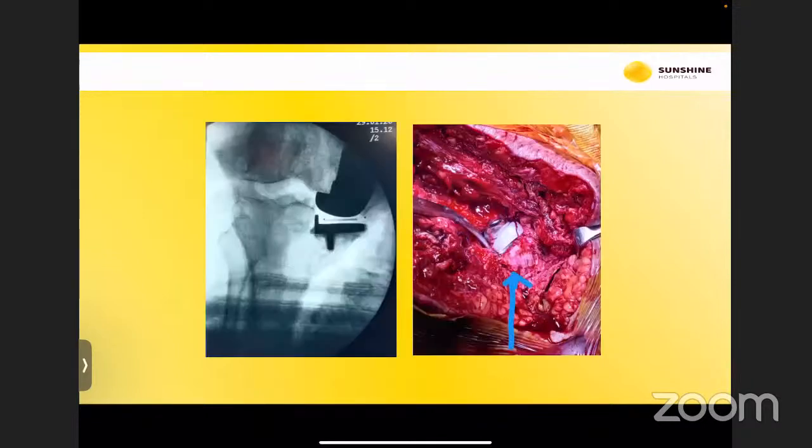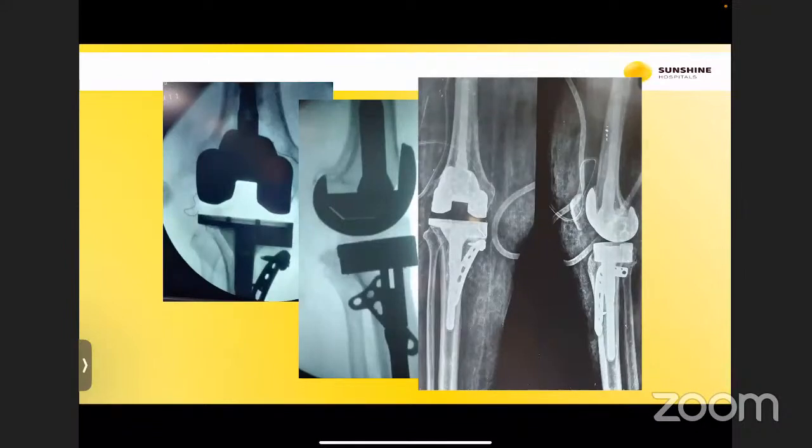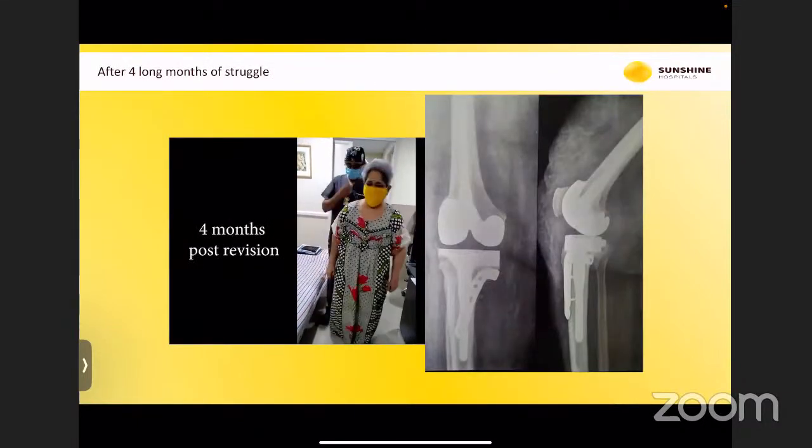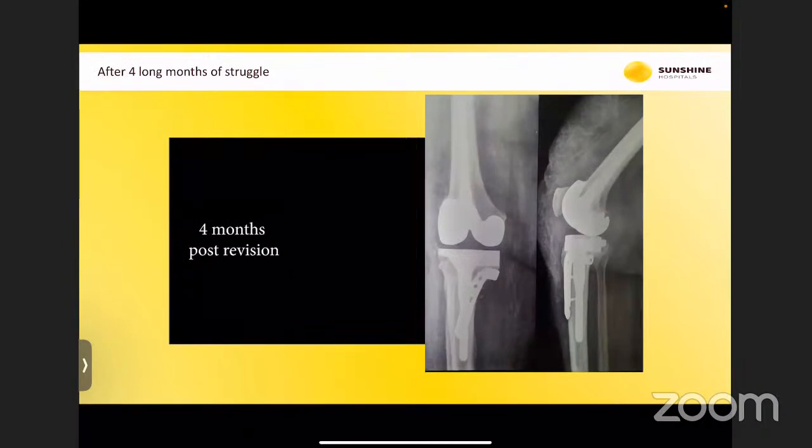So how do you revise such a case? What do you do in such an incident? We went in with a trauma surgeon's help. We opened up, we had to take out this piece of bone, and we ended up doing a revision total knee replacement with a wedge as well as a rod and a plate support over here. Not every uni revision requires this. You can get away with a regular primary TKR as well. But here, because she had a big condyle fracture, we had to. After 4 months, she's doing much, much better. But this can happen. We just wanted to let you know about it.